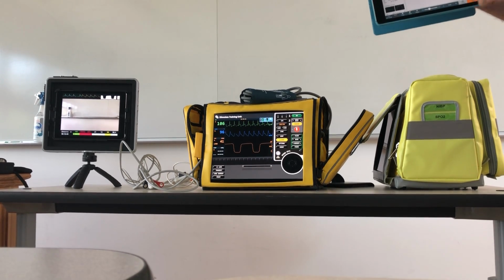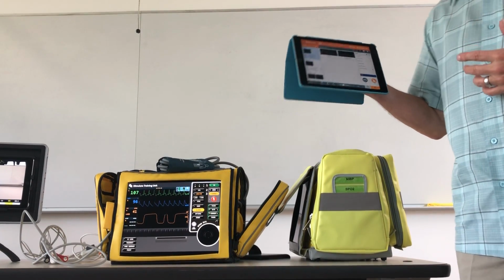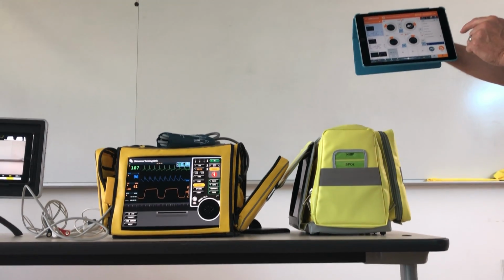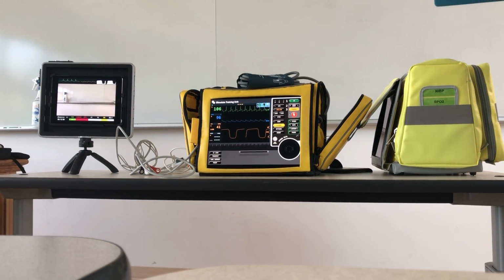Pulse ox, you only have 2 waveforms to pick from. You have normal or poor perfusion, but you can change the pleth so it has a little bit different appearance to it if you want them to pay attention or notice that, yeah, their number's okay, but that waveform's really not impressive. So it has that, but those are the only 2 choices.